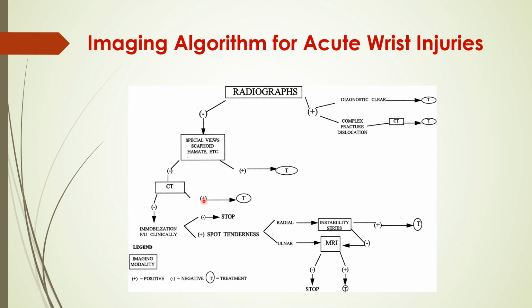What it does not give is the soft tissue injuries, so they can be found out by using an MR. In case you suspect there is some injury to a ligament, it's better to go ahead with an MR.